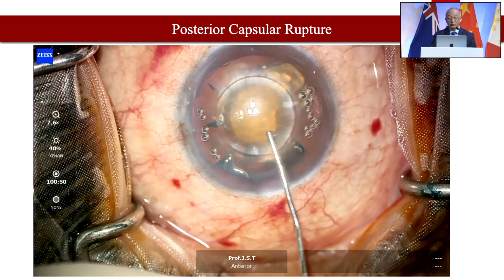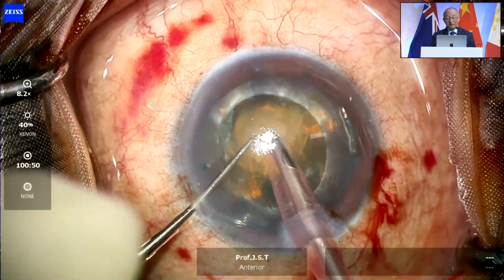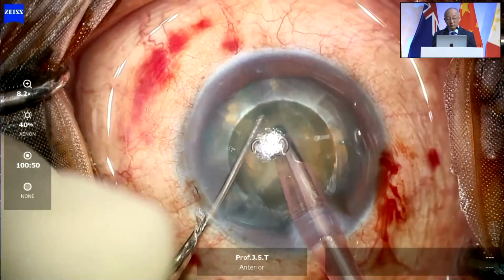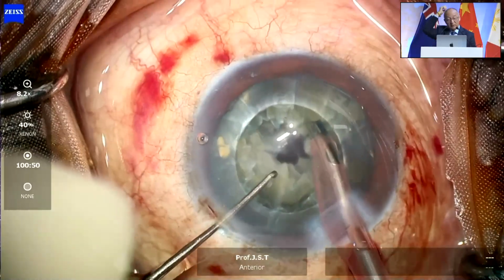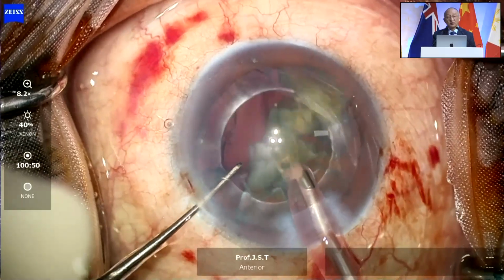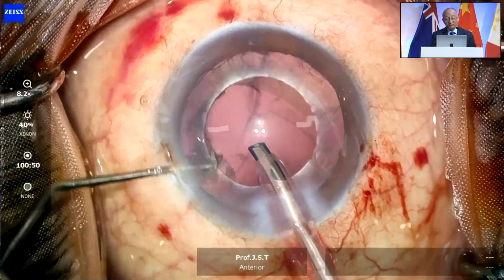This is one case I want to show you, that things can go wrong anytime. This is a femtosecond laser. This patient has undergone a trifocal toric lens in the other eye. This is the second eye I am operating under femtosecond laser assistance, a very nice capsulotomy being done. The nucleus is being fragmented as per the chop pattern which was there in this particular nucleus. Remove the nucleus effectively within the bag now. The surgery becomes very simple once you have femtosecond laser because you have a nicely oriented capsulotomy. Also nucleus fragmentation and chop pattern, this is a LenSx platform, can be done effectively.